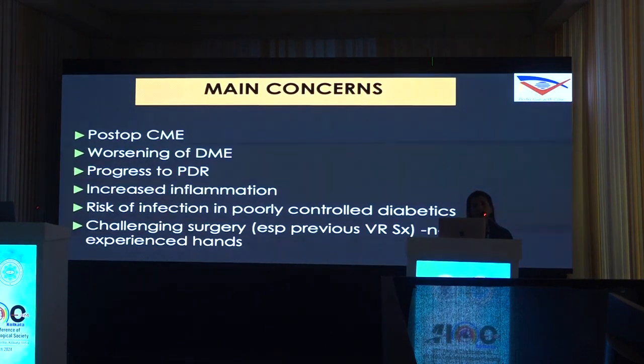So what are the main concerns? The main concerns are that there's an increased chance of post-op CME. There could be a worsening of diabetic macular edema and a progression to PDR. As we know, diabetic patients are more prone to inflammation, so inflammation can be increased after the cataract surgery.